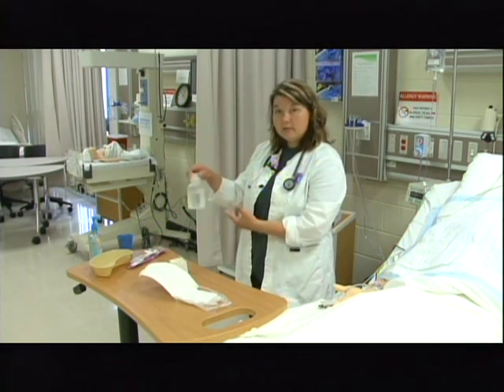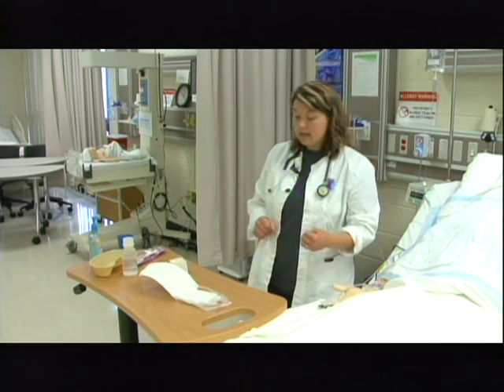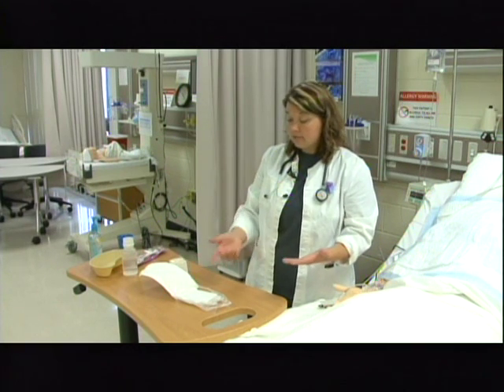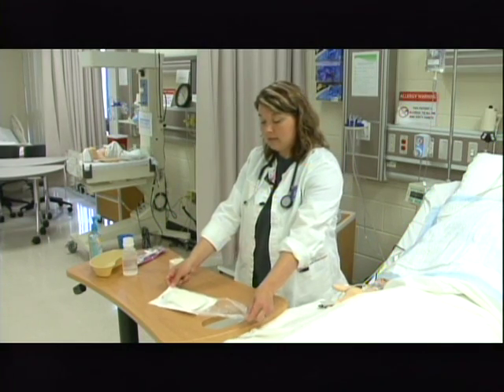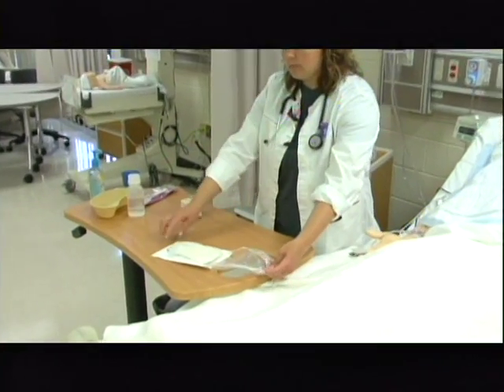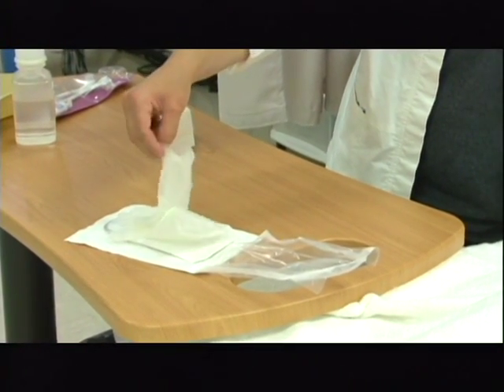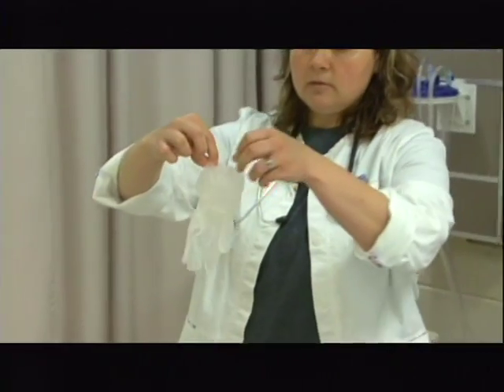If you end up having to add more liquid later while sterile, you could leave the lid off, but I usually add enough liquid so I don't have to worry about it. The next step is to put on my sterile gloves so I can manipulate the suction catheter. As long as I have not touched anything inside, I can simply close the cover and flip it over to get my sterile gloves. Another option is to bring a separate set of sterile gloves and put those on separately. I'm going to go ahead, as I have not contaminated anything to this point, and get the gloves apart.